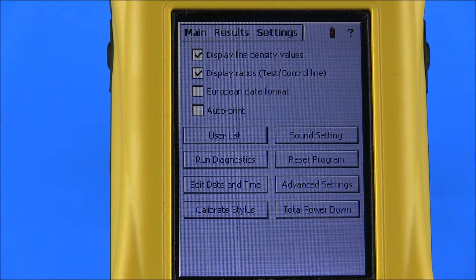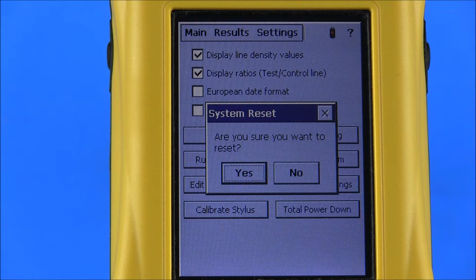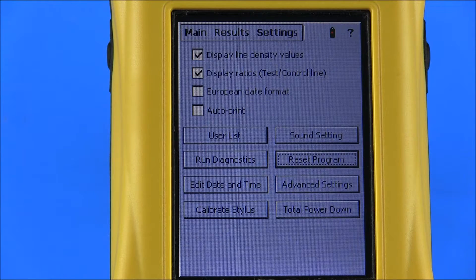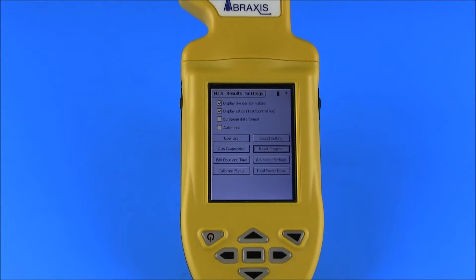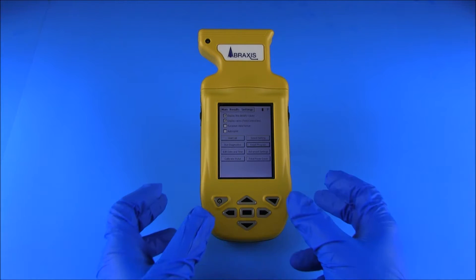To reset the program, select Settings from the User Control menu, then select Reset Program. The reader will take a few seconds to reset. In cases where resetting the program does not fully solve a software or hardware issue, a reboot may be necessary. The reboot will exit the operating system and shut down the reader, then restart both the reader and the program. To reboot the reader, press and hold the Power button and the Screen Brightness button until the screen turns white, then release. The reader will take a few seconds to reboot, and once complete, the main menu will display.